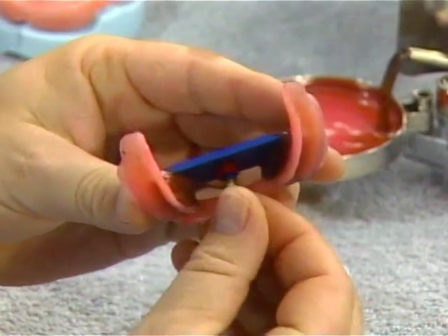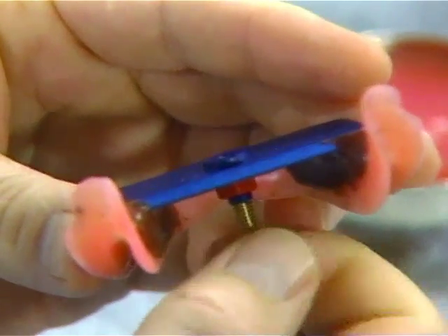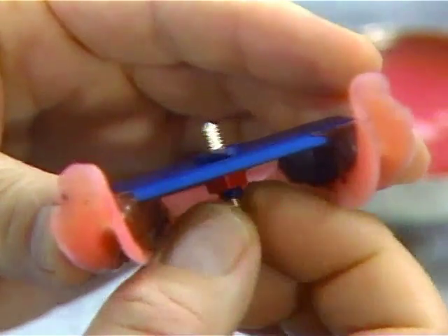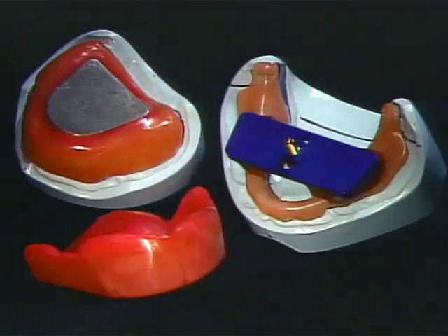Screw the ball bearing end of the large pin into the sleeve from the bottom and run it up and down to be sure it moves freely. The pin should extend half of its length above the blue bar. The ball bearing bite recorder is now ready for the dentist. When you send the bite recorder to the dentist, be sure you also send the other parts of the bite recorder kit and the aesthetic control base for aesthetic recordings.